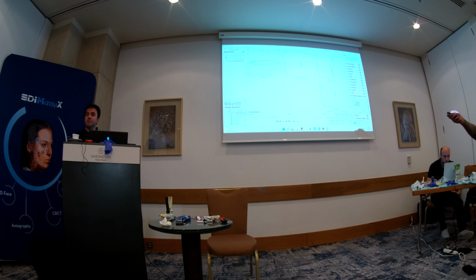So he has two clicks. So at this click here, he's losing the disc, and he recaptures, and then he comes back to the bite. Like we can diagnose, seeing these lines without a CBCT, how is the occlusion of the patient, based on the velocity and whatever happened with this discrepancy of the lines.